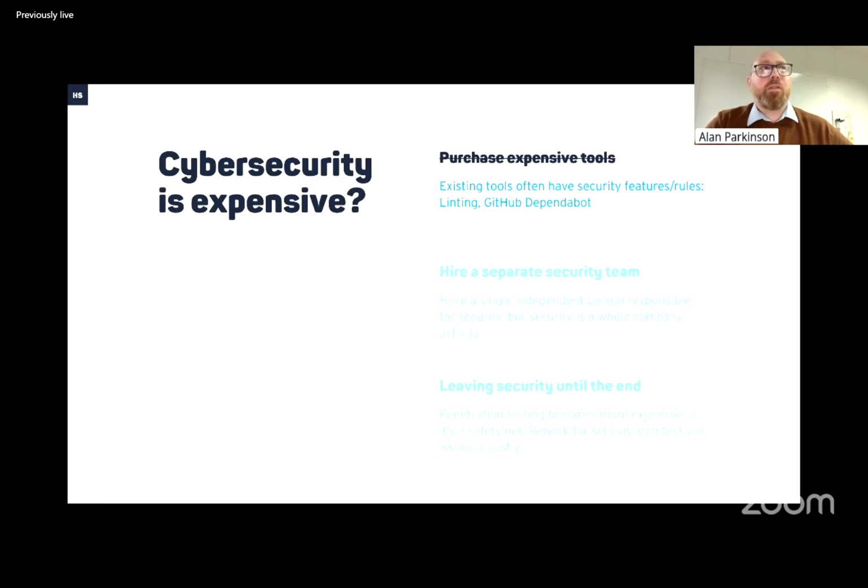but it's a really quick win at no additional cost. If you're using a linting tool, there are probably additional rule sets for it. Some of those will be security based, and you can select those and implement those. Again, it doesn't take long to do.